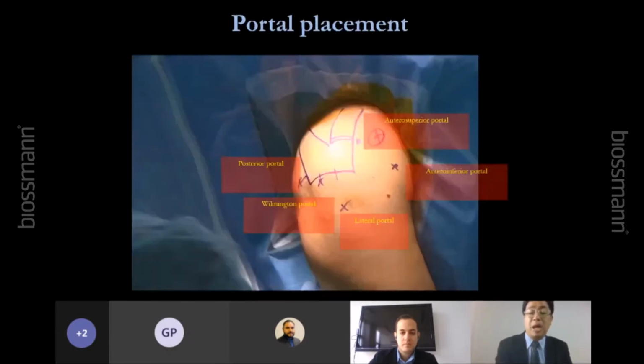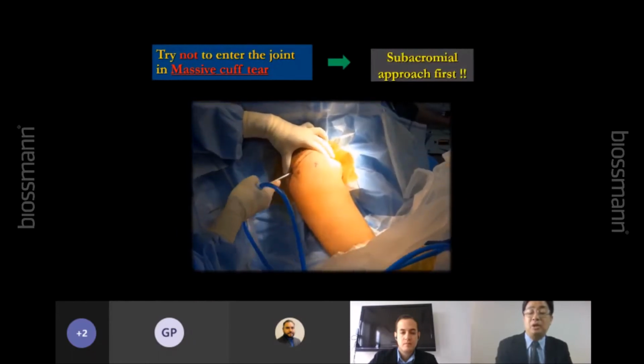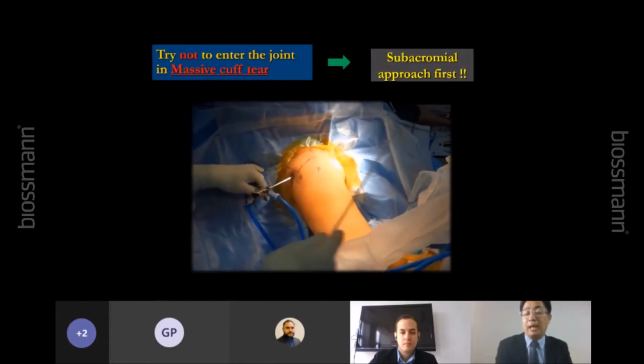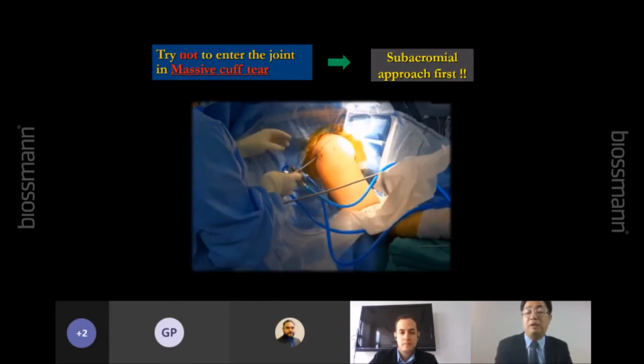I prefer the beach chair position, and this is my portal. Okay, I always use about 5 portals like this. Okay, 1 in the back, 2 at the side, and 2 in the front, right? So I will use only 5 portals. In the patient with a massive tear, I try not to penetrate the posterior cuff. I will go directly into the subacromial space.